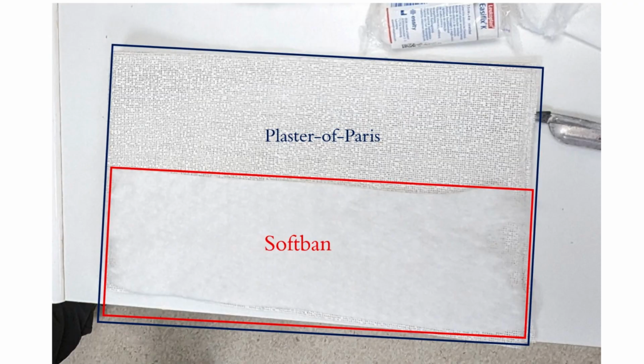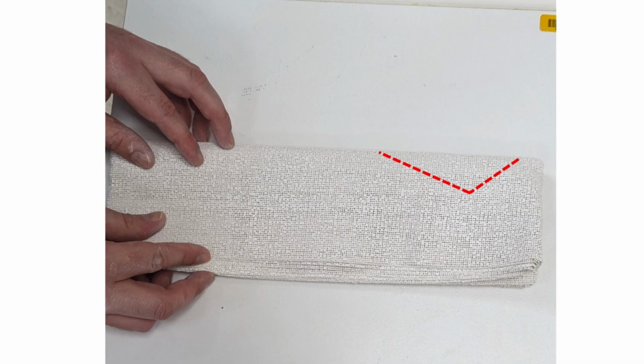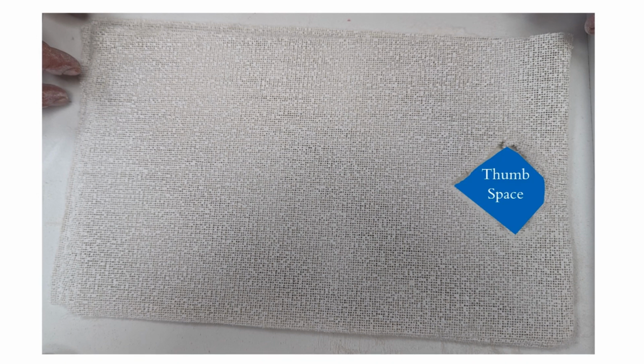Measured against the already cut soft band, this will give you the length and thickness for the plaster of Paris required for the cast. Folding the plaster of Paris in half long ways, you then cut a triangle-shaped wedge along the inside edge about 1 centimeter from the end. Unfolding this gives you a diamond-shaped wedge which acts as a thumb space for the patient.